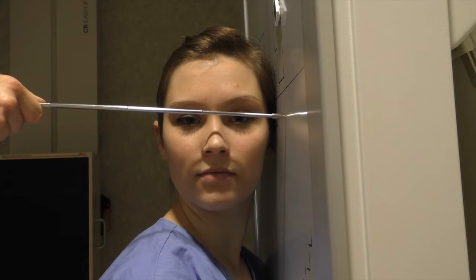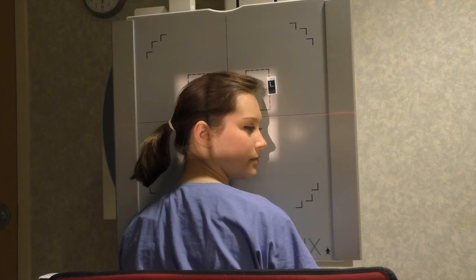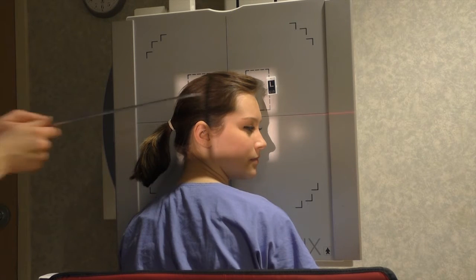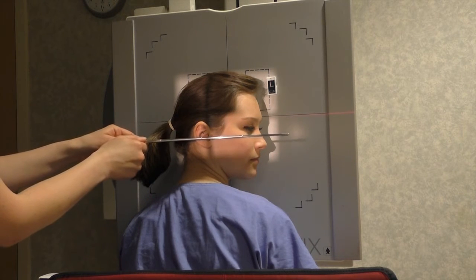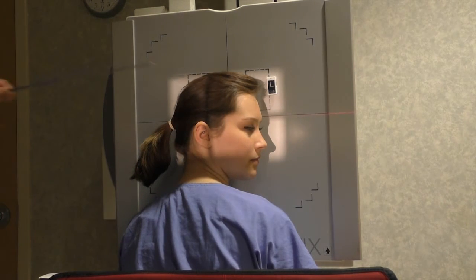For the lateral position, there should be no tube angle. The affected side is placed against the board. To ensure no tilt or rotation, the IPL is perpendicular to the IR. The mid-sagittal plane is parallel to the IR. The IOML should be parallel to the floor, center 2 inches superior to the EAM, or halfway between the glabella and inion. Collimate around the area of interest. Marker is placed on the correct anatomical side. Suspend respiration.